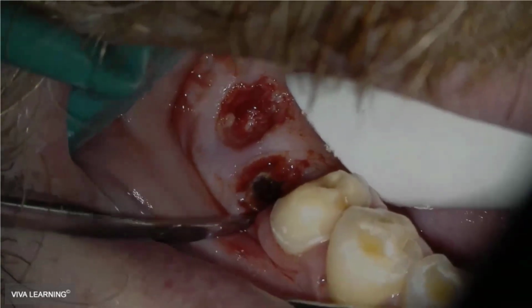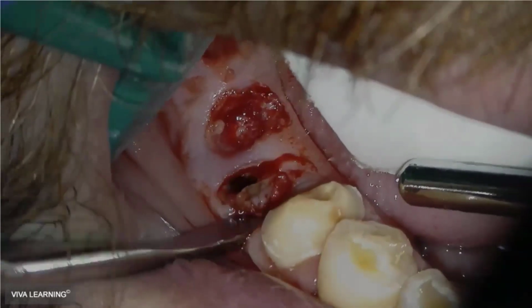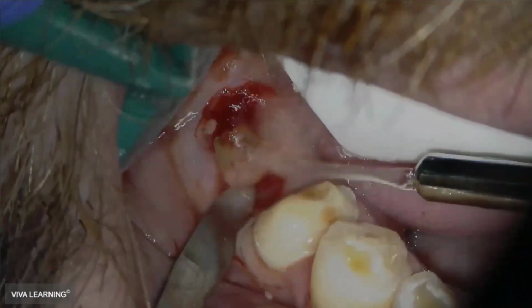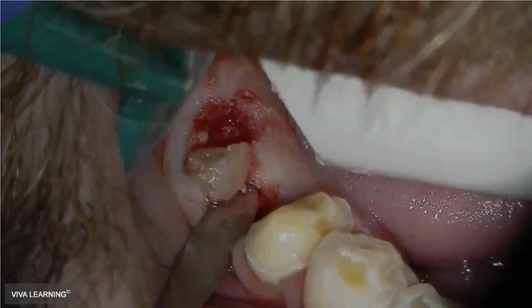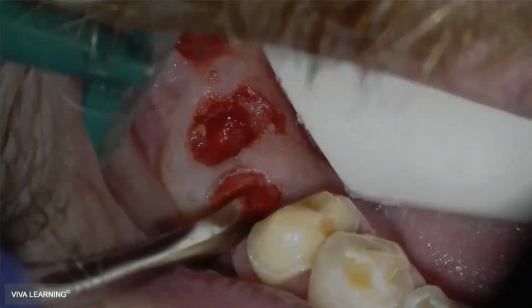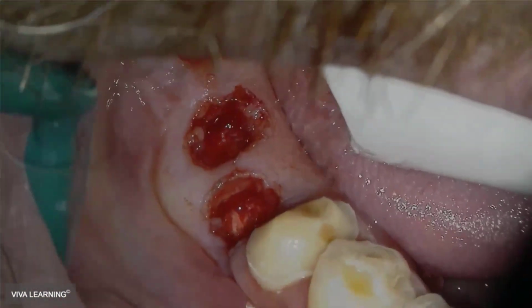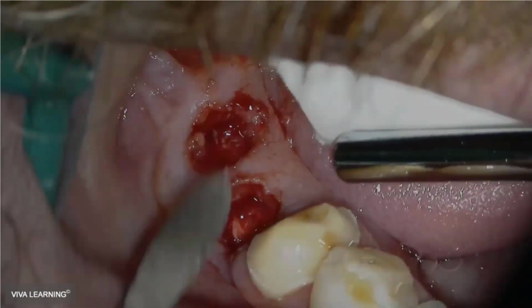And so it's not like you get side damage, you know, your question of iatrogenic damage or going too deep. You really have to hold it incorrectly, like point it at the wrong spot on the tooth. The other trick there is my laser energy when I'm doing those frenectomies is always down the long axis of the tooth, not pointed toward the tooth, if that makes sense. So I don't have anything pointed toward a root surface that could actually cause that problem.